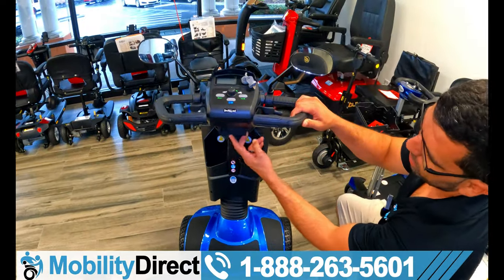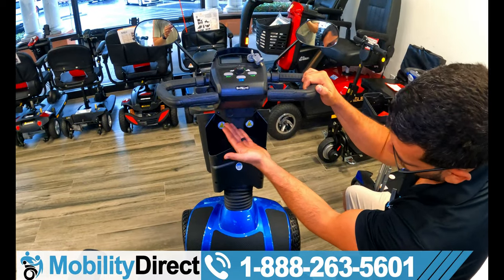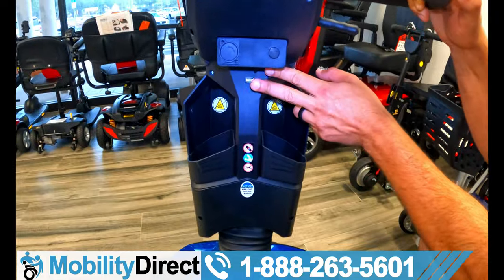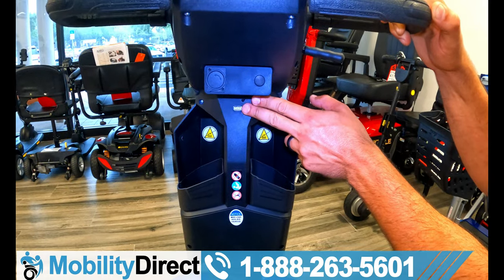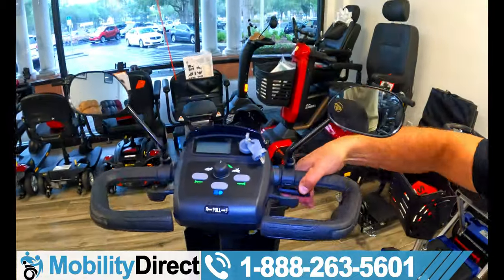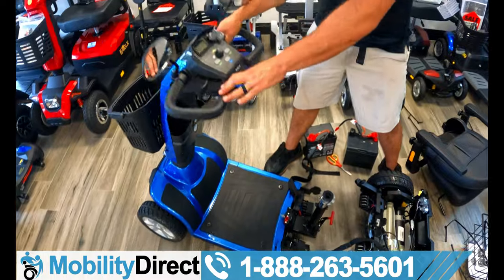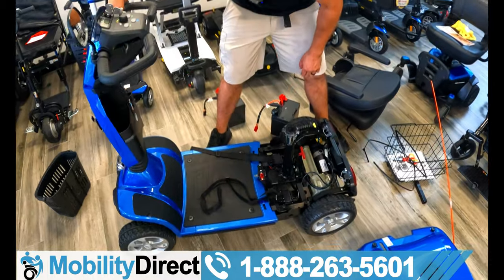There's a charging port on the dash so you can charge the scooter without bending down. There's also a USB charging port so you can charge your cell phone, tablet, headphones, or any USB-powered device. This handle allows you to tilt the entire tiller closer to you or further away, and when taking it apart for transport, you lower it all the way down after removing the seat so it's completely out of the way.